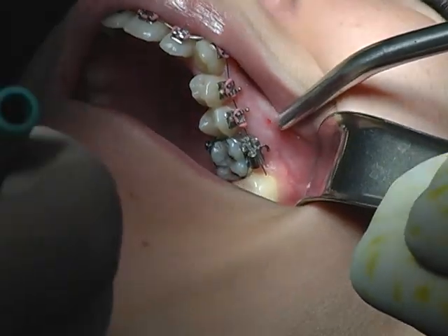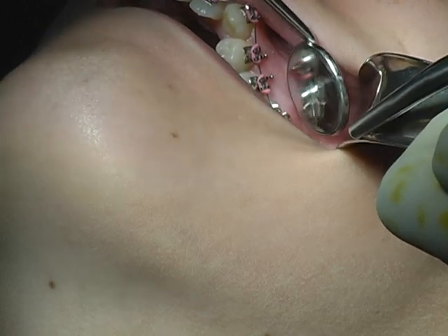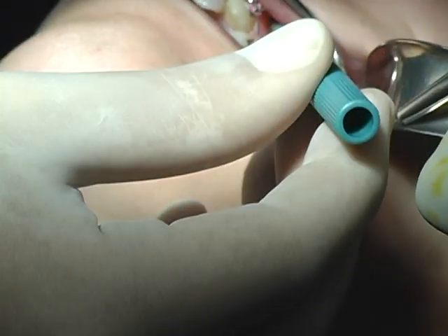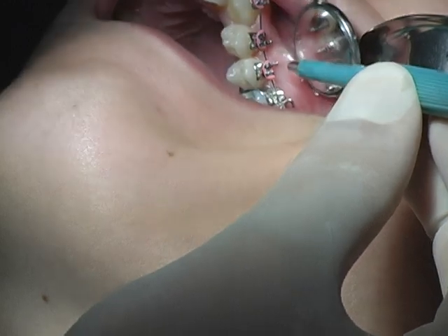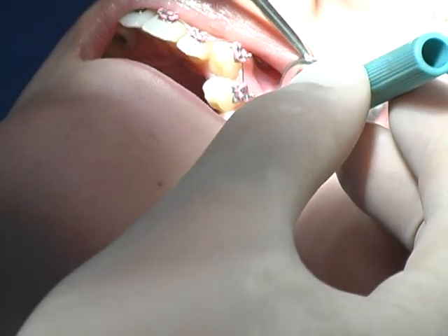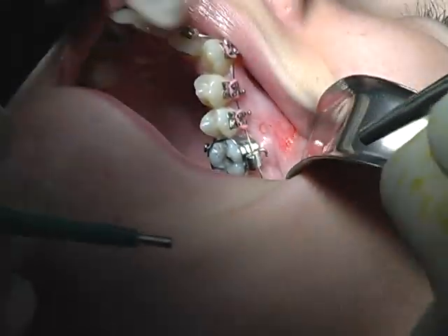I take my punch. First of all, I pull a little bit on the soft tissues to see where's the border between attached gingiva and mucosa — and it's right here. I can mark this with my mirror. So this might be a good spot. Just a gentle pressure. And as you can see, we have the ring here. Now I can look from all sides if this is a good spot. That seems to be a good spot.